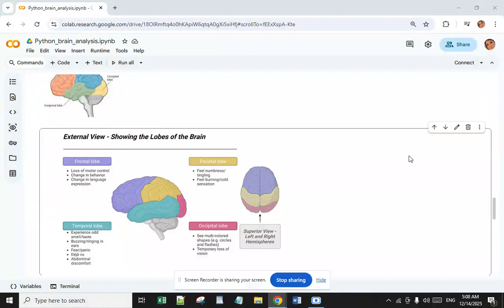And the next important library and feature is NiPy.org. NiPy.org is a community of practice devoted to the use of the Python programming language in the analysis of neuroimaging data. You can find it on GitHub as well as social media, and contributions are welcome, and we ask that you read about the standard of conduct.